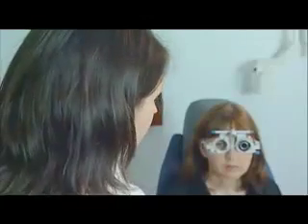So we're going to start measuring your visual acuity now, using the chart that's just at the end of the room. What I'd like you to do is to read from the top left-hand corner, along each line, one letter at a time, and then down each line, one at a time.